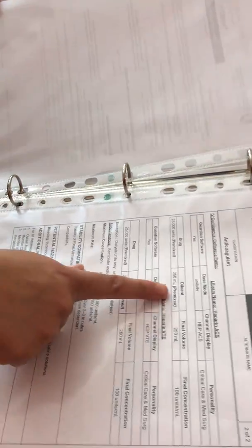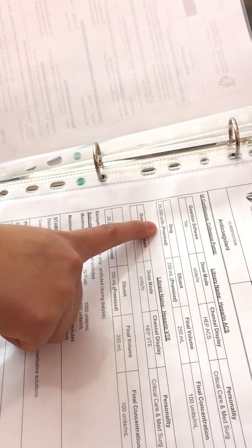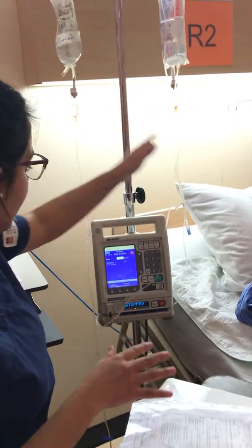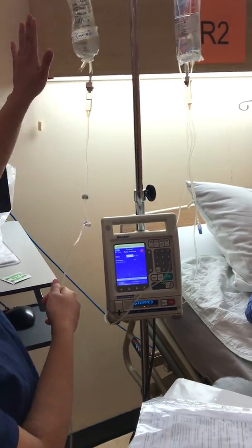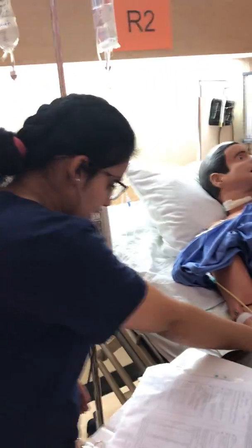I've already checked during my preparation that this bag is prepared right by the pharmacy, with the right final concentration, right volume, and the right drug dose, which is premixed. Once everything is done, I'm going to tell my patient about the side effects. I'm also going to make sure that my normal saline, which is running by gravity, is attached to my patient. It is attached to my patient, so that's good.